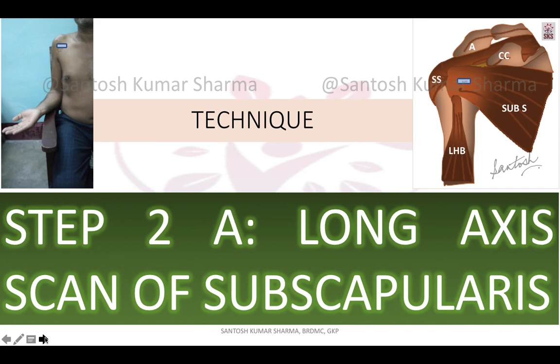Now coming to the subscapularis tendon, this again we start with the long axis scan of subscapularis.